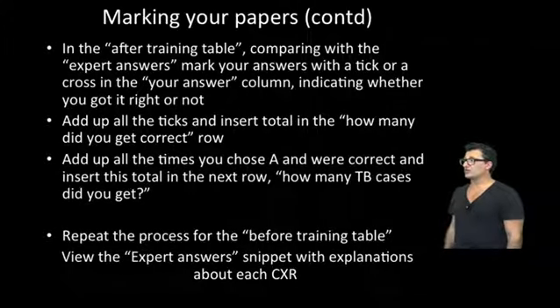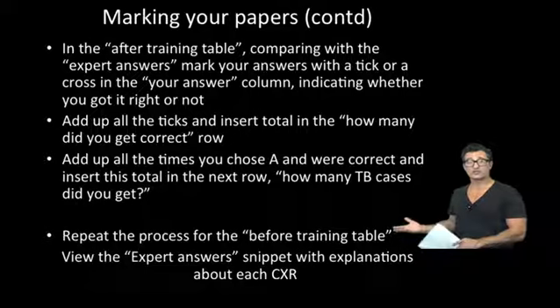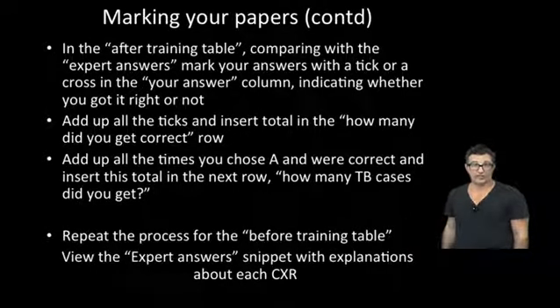The expert answers and a snippet of explanations for each of the X-rays will follow as soon as you've done your marking.